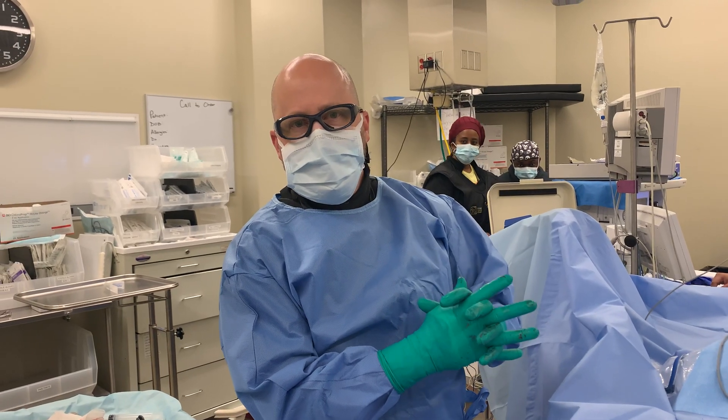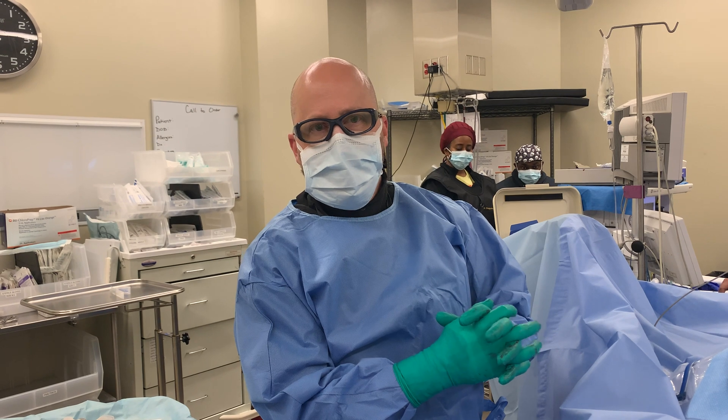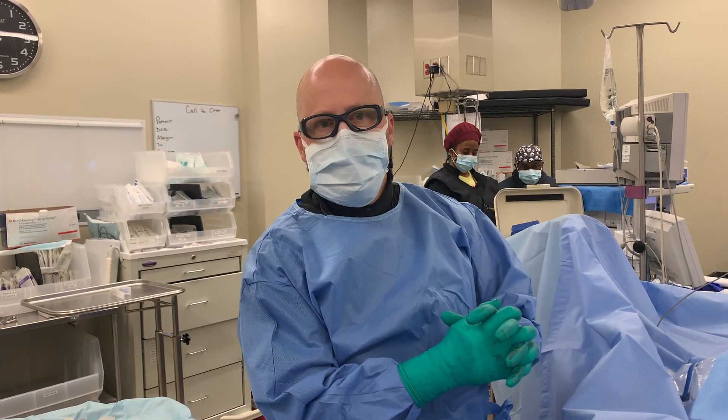So we've reached our target in the S1 vertebral body and now we're performing the ablation for that level.